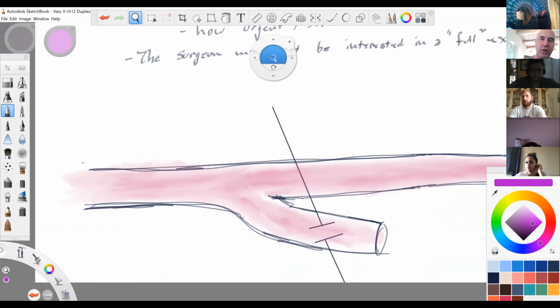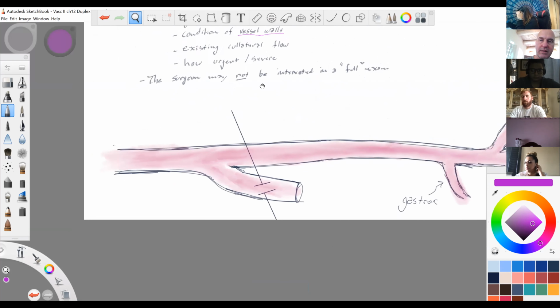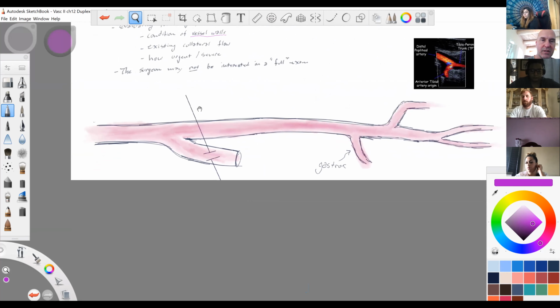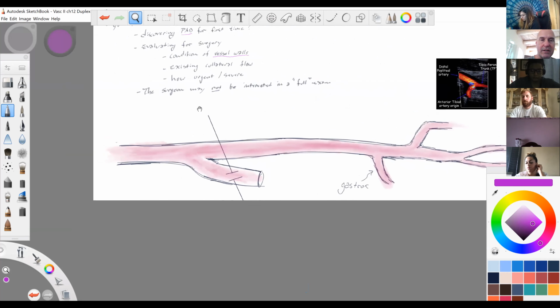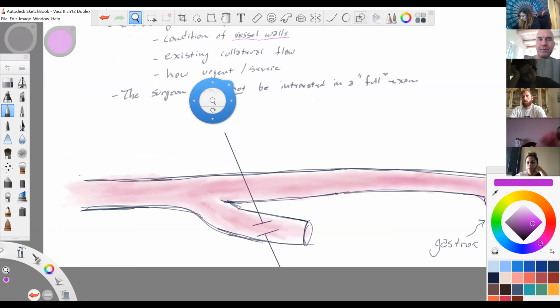All right. So I drew out our little system here. Well, I'll zoom in a little bit here. Better. I put the spectral in the profunda, or the deep artery, to remind me. I think I've already told most of you this anyway.